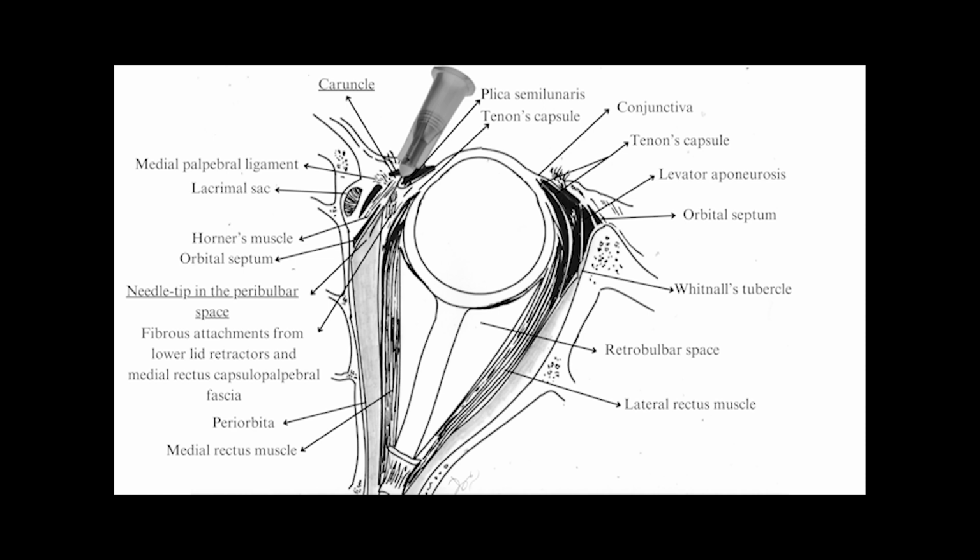Caruncular anesthesia, thus, is superior to subtenons anesthesia, especially in combined cataract and vitreoretinal surgeries. Because subtenons anesthesia involves a conjunctival incision to access the subtenon space for injecting the local anesthetic via a blunt cannula into the subtenon space, most of these cases will have significant subconjunctival hemorrhage and chemosis.